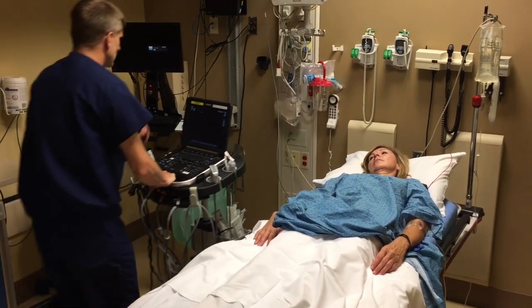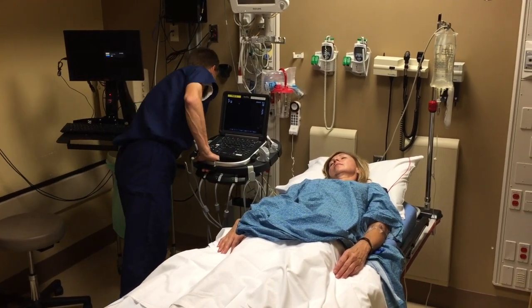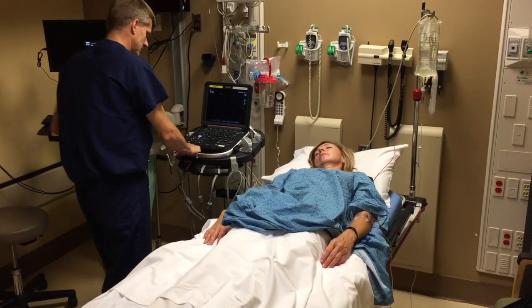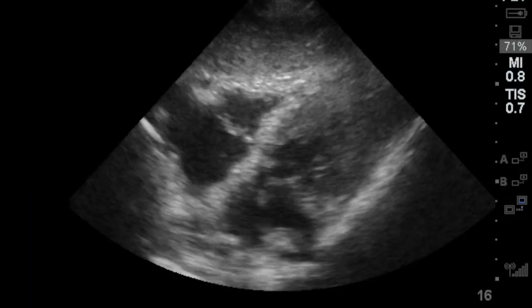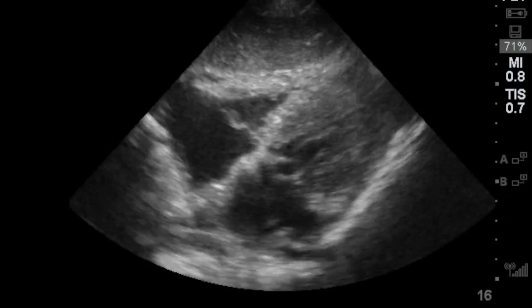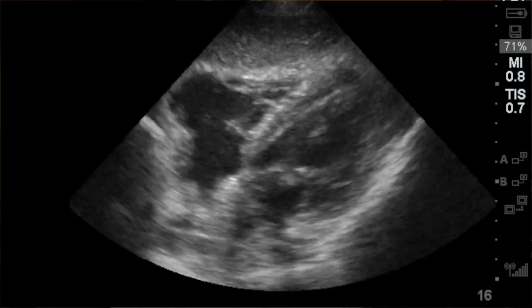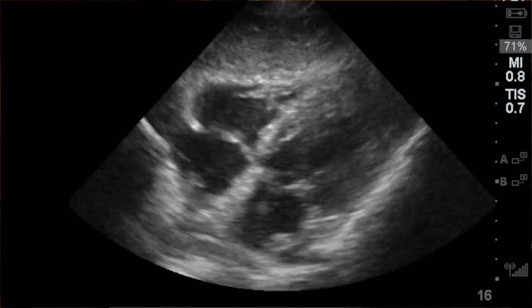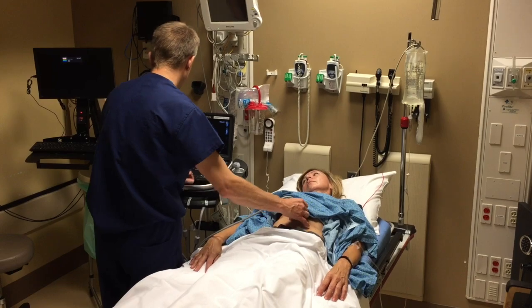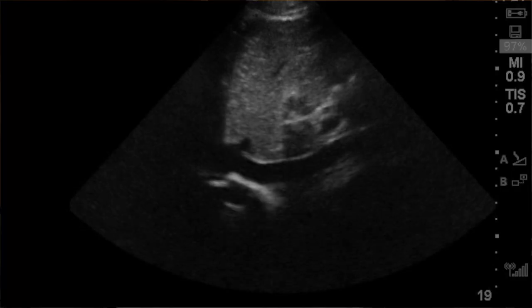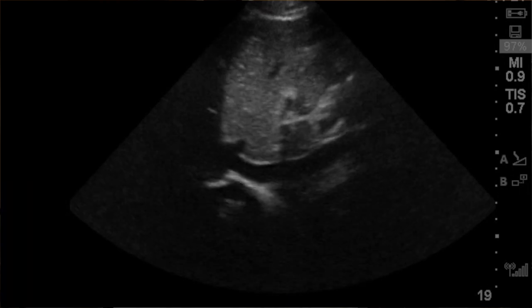Next patient — no English again. Let's see what ultrasound can tell us. Using the HI-MAP again. Start with the heart — that is a hyperdynamic heart, the LV is squeezing very strongly. Let's take a look at the IVC — that IVC is completely flat. This looks like a volume issue. Not sure why, but let's go to Morrison's.